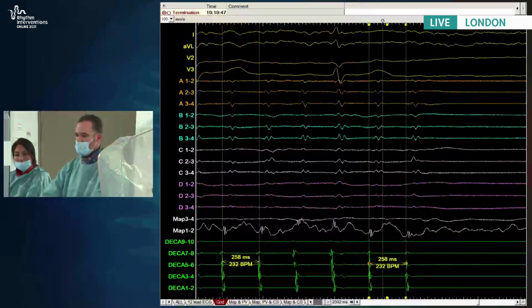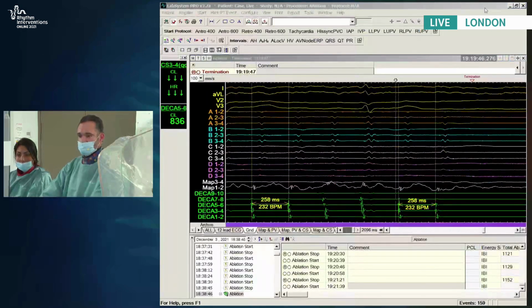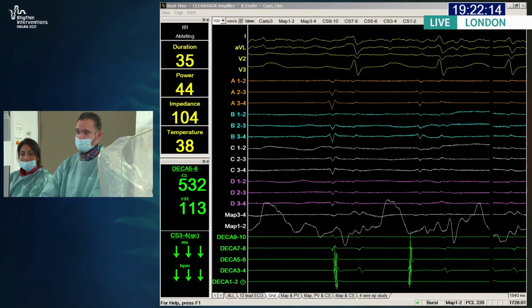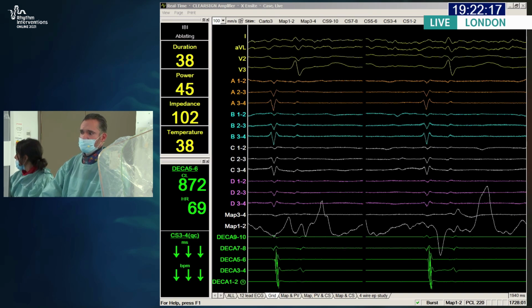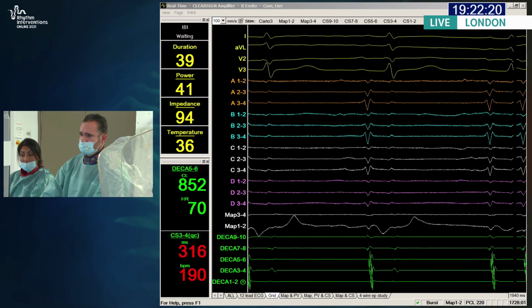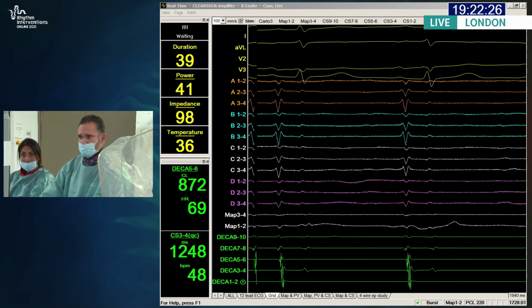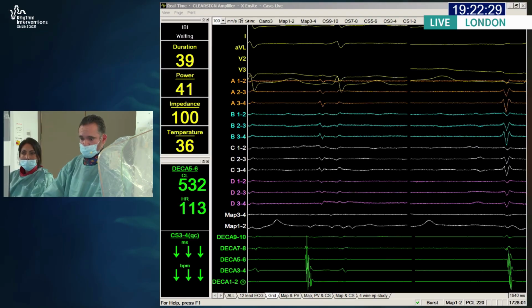Can we switch them around to see the live BARD signals again? And Aldo, what about you with pre-procedural imaging? We tend to use a lot of MRI, Richard, rightly or wrongly. We do sometimes base decisions on the left atrial size and the presence of scar. I think Dr. Calkins earlier mentioned the use of hybrid surgical approaches, and that was going to be one of my questions. In this group of patients, is there a cutoff in terms of the longevity of the atrial fibrillation or the atrial dimensions in which you would consider either not undertaking an ablation or considering a hybrid type of ablation?